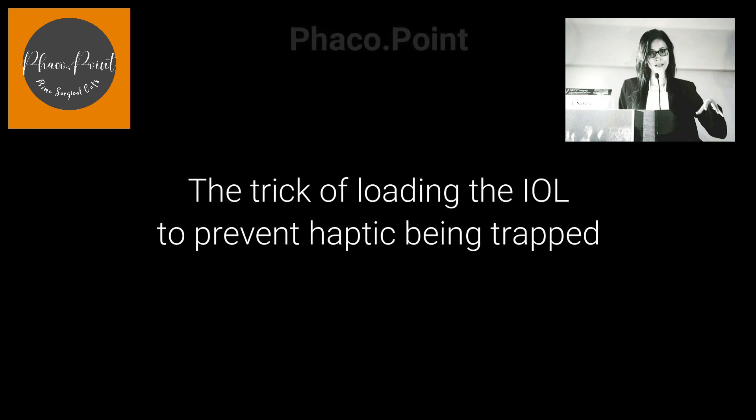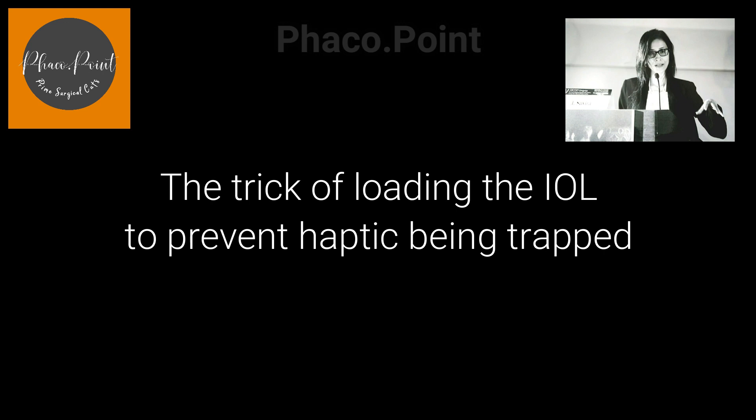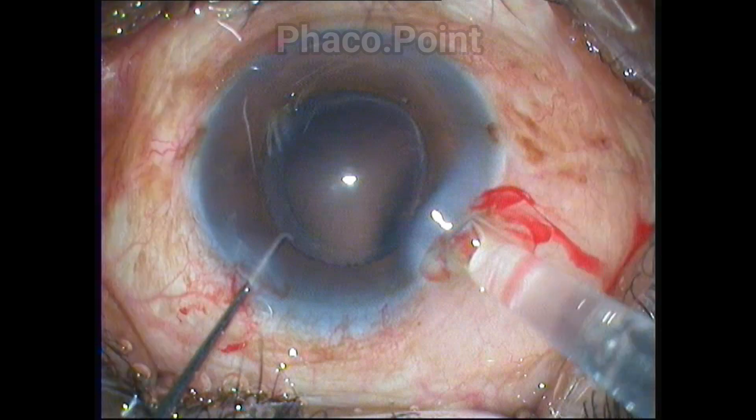It is not uncommon to find a broken haptic while inserting the IOL into the eye. This video will depict a very simple trick that helps you consistently achieve an optimal end result — that is, the entire IOL being inserted into the eye without any broken haptics. Let's look at what happens in the following video.